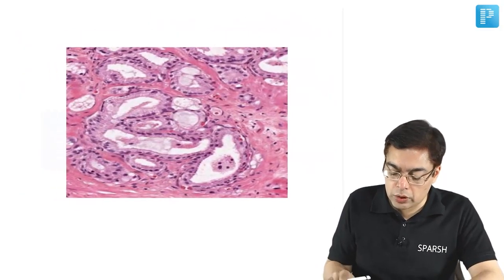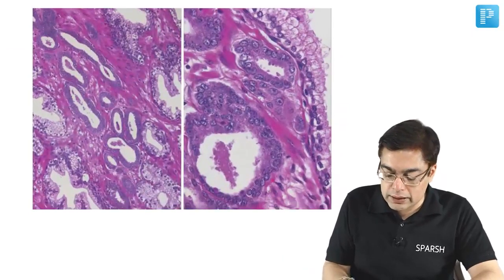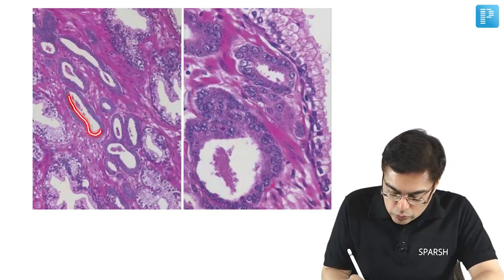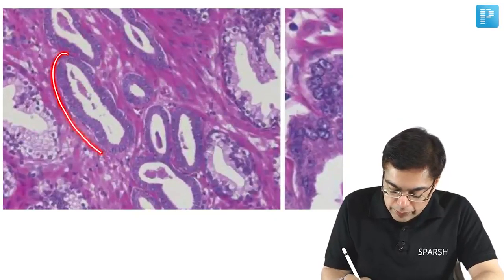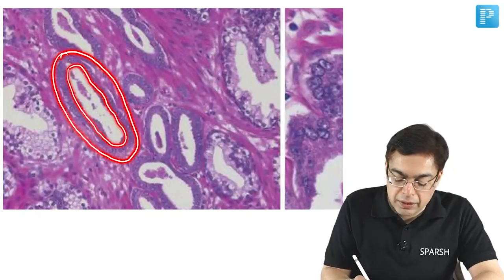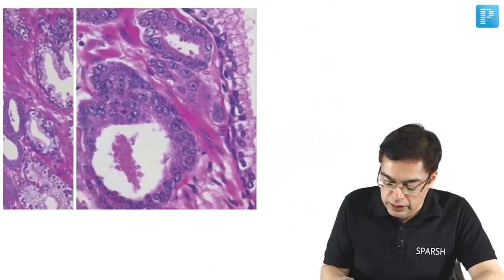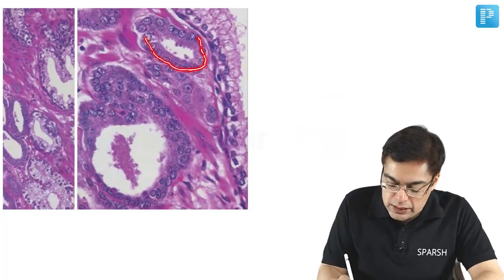Another important thing to be remembered over here is that this kind of slide can be given, which is more explanatory in the sense that on the left side is the presence of a low power magnification. So you can see the presence of, that's the only layer of cell that you can make out in the slide. I will just enlarge it for you. You can immediately appreciate the fact that there is presence of a hyperchromatic nucleus. Cells are appearing far darker than they should, and there is just one layer of the cells, better appreciated at the higher magnification, wherein you can see those malignant cells.